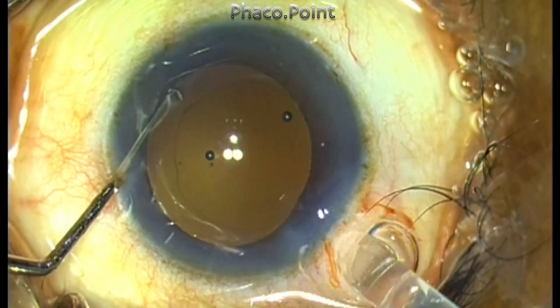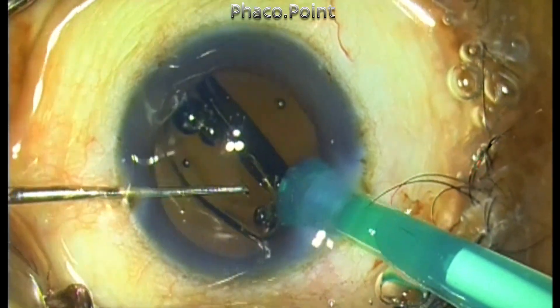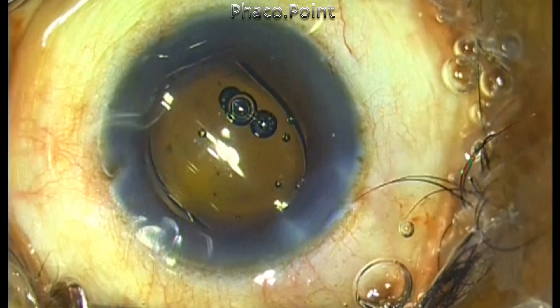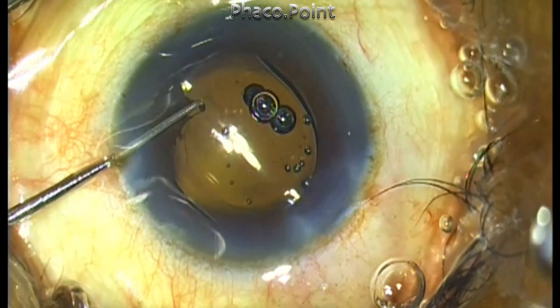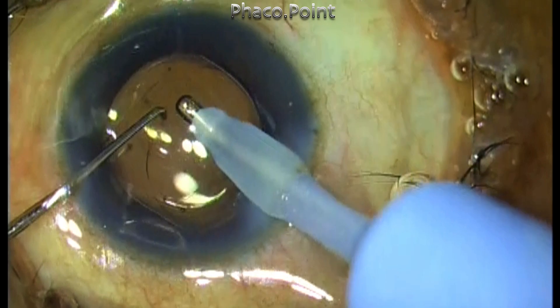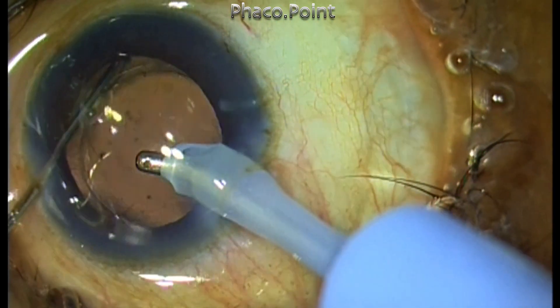The intraocular lens is then implanted as an additional safety precaution. I locate the haptics of the lens in the area of the zonular dialysis, hoping that the pressure of the haptic will provide an additional buttress and support to the dialyzed zonular area.